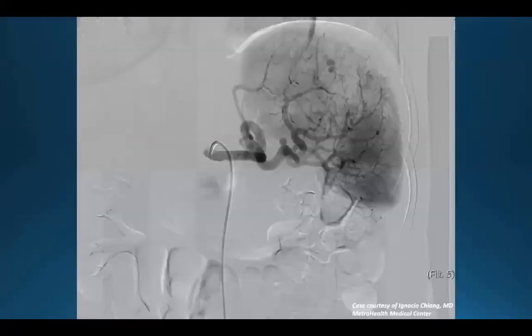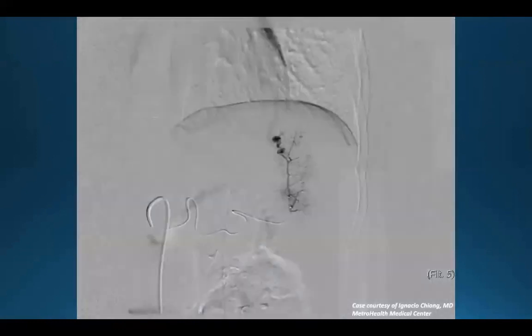An example. This was a grade 3 injury seen on CT, which is less well appreciated on the angiogram. Here we're looking at the angiogram, so it'd be difficult to grade, but what we see is significantly decreased perfusion to the upper portion of the spleen. Additionally, there's a focal pseudoaneurysm. In this case, we used a microcatheter to select the vessel that was supplying the pseudoaneurysm. You can see it there, pointed out by the arrow.